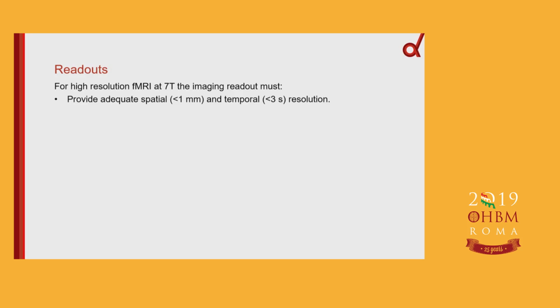I've realized in the passage of time that physicists actually have a tendency to make life difficult for themselves in doing laminar fMRI, in that they tend to very strongly stimulate the primary visual cortex, which happens to be one of the thinnest pieces of isocortex in the brain, whereas if you go off into a nice language or memory region, you might actually have 3 or 4 millimeters of grey matter to play with, and then the resolution that you need, of course, scales to some extent as well. So let's say we're targeting under 1 millimeter.